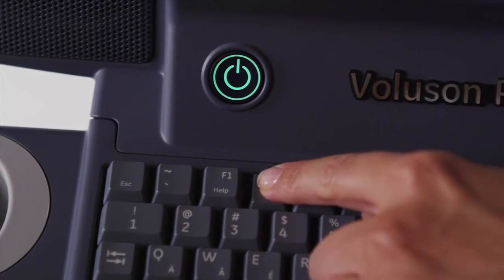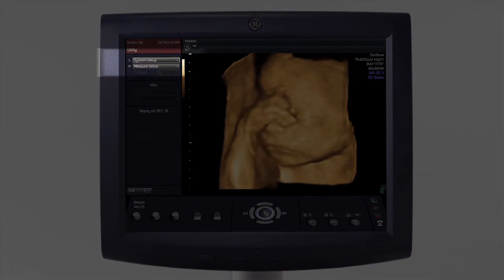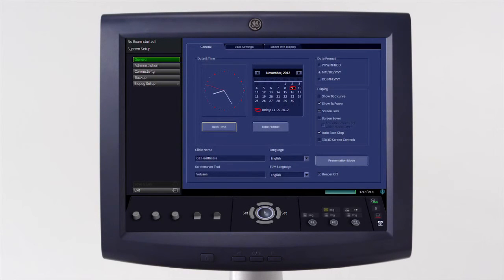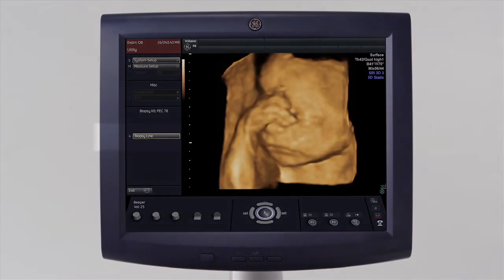The utility key on the alphanumeric keyboard will bring up options on the display menu. To customize items such as annotations library, presets, print keys, and any other configurations, select System. To customize the measurement packages and options, select Measure. The utility menu is also where biopsy lines can be activated.